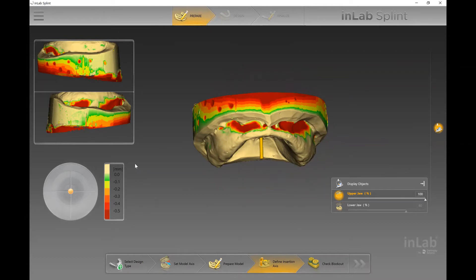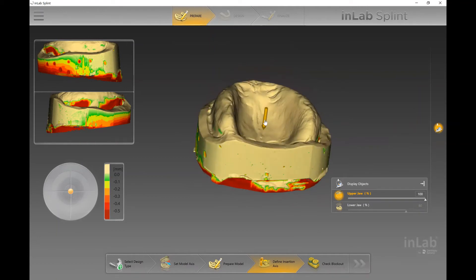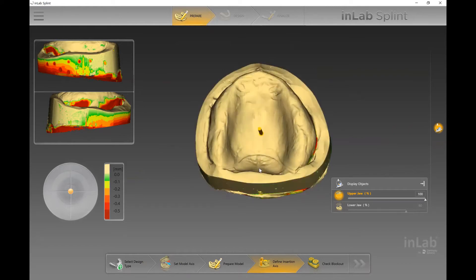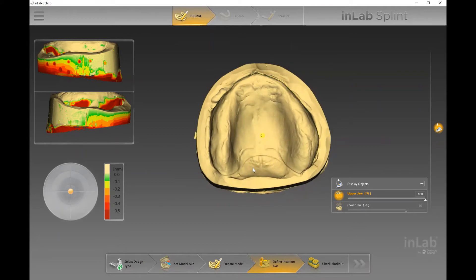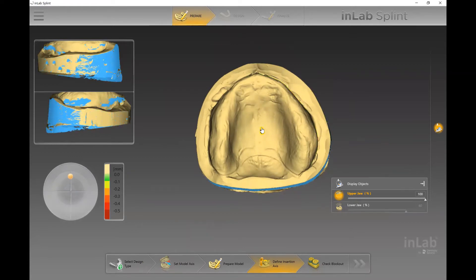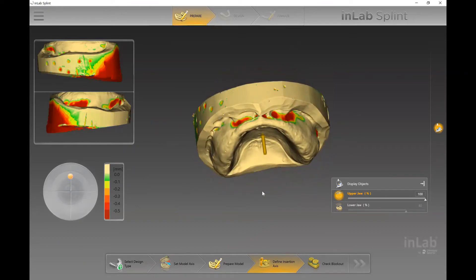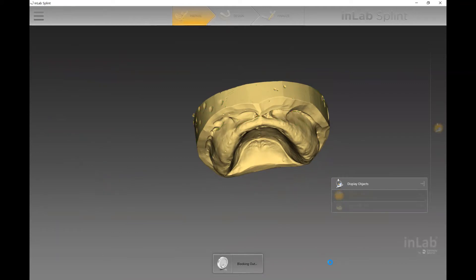If there's nothing to do in 'Set Model Axis' or 'Prepare Model,' the first step where you actually have to complete something is 'Define Insertion Axis.' In the lower left there's a legend showing undercut values in millimeters, and we're trying to minimize them as much as possible. The software places the pin at roughly a 90-degree angle from the tip of the arrow to the palate. If we tilt it to around 75–80 degrees, we minimize those undercuts further into the vestibule region. There will often be undercuts there, especially for upper dentures, but we can rely on the software to block them out in the 'Check Block Out' stage.